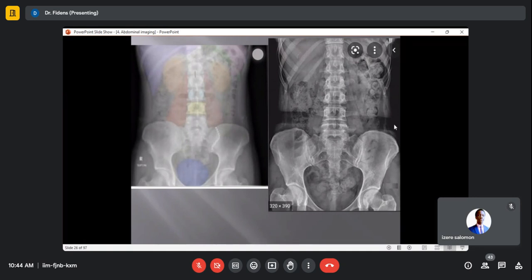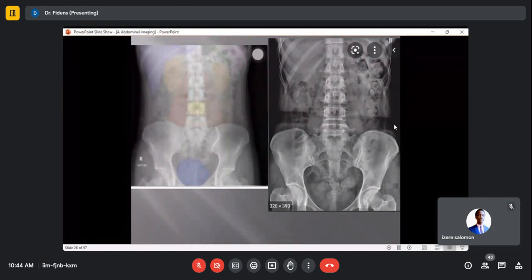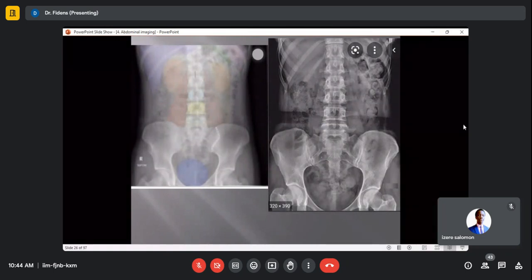Lecturer, but I have some confusion. The confusion I have for this systematic approach for abdominal X-ray: we start by identification of the patient, and the second was ABCS. Then the technical details and those interventions, do they come after ABCS or are they the same?